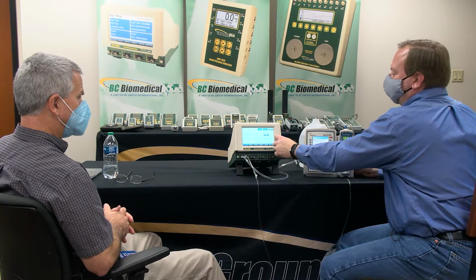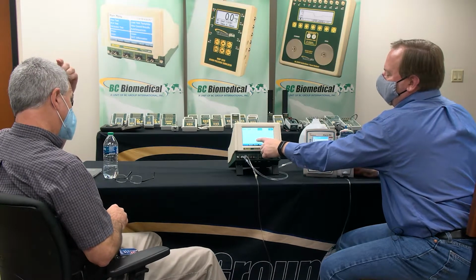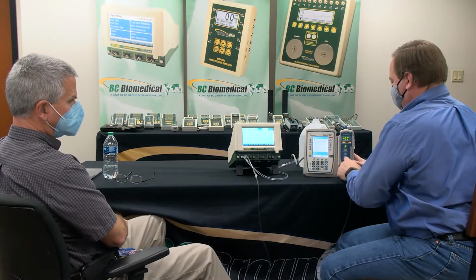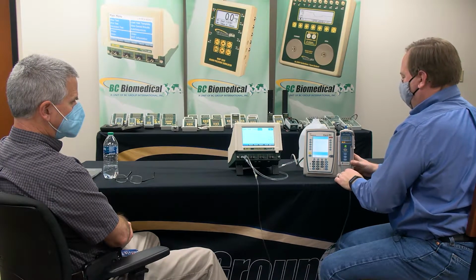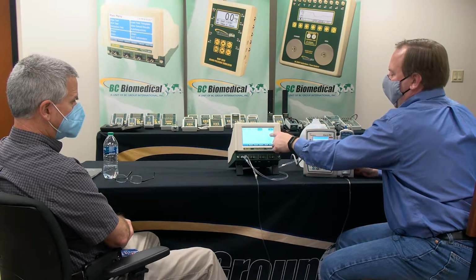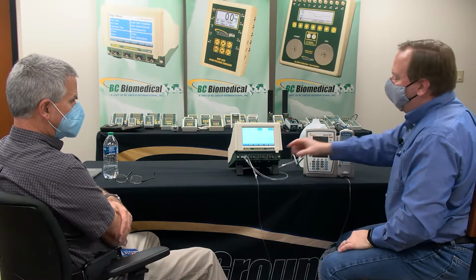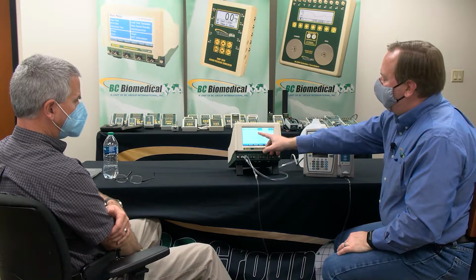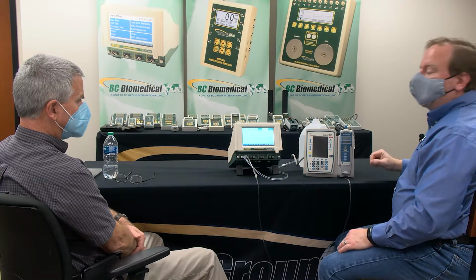And then there's a graph of this, so we can watch the pressure, peak pressure occurs here. If I was faster with my alarm, I'd be watching this, and as soon as it beeped, I would hit it, then it would show that was the end of the test there. But we can see it got to its peak pressure, and it never delivered any more. The pressure just kind of dropped off. That's what we're looking for in the occlusion, so that it doesn't just hit it, and then, oh yeah, I'm gonna try and keep going and going and going.